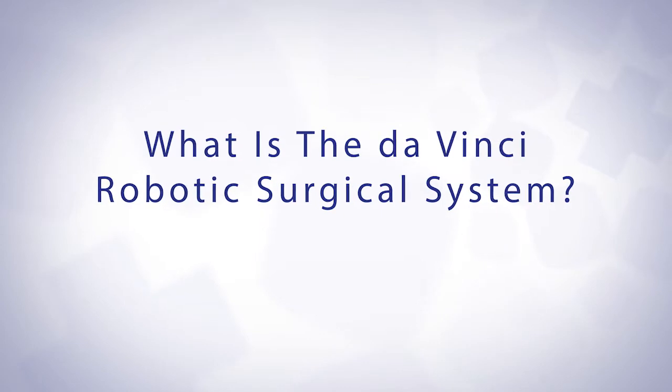What the da Vinci robot does is take our hands off of the instruments and the camera and attach them to this robotic machine. The surgeon uses a console that sits in the room — we put our hands into it, use these controllers, and look into the console that gives us the camera view. Our hands manipulate the robot and move the camera, so it's essentially a tool that's allowed us to become more precise and have better visualization in minimally invasive surgery.